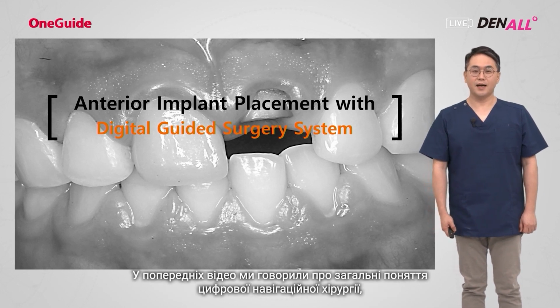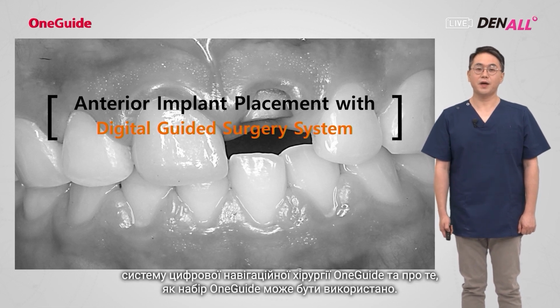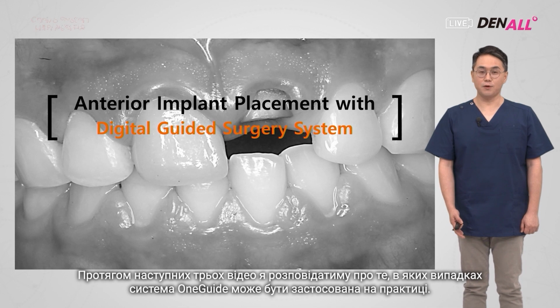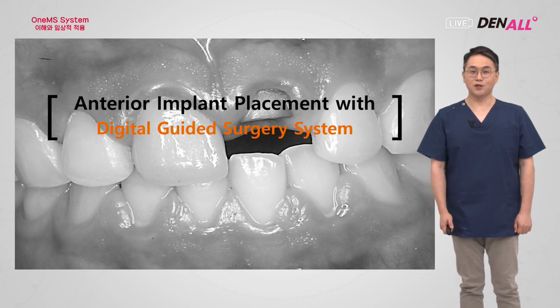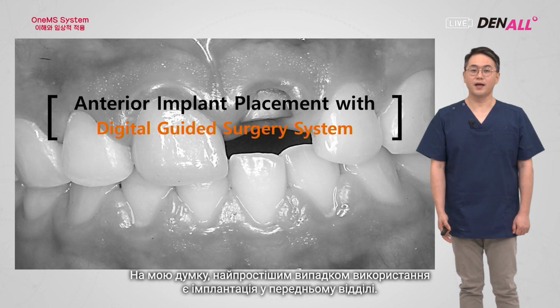We looked at the overview of the digital guided surgery system, and I also introduced the One Guide system. And lastly, we looked at how the One Guide kit can be used in the last sessions. For the next 3 sessions, I'm going to tell you in which cases this One Guide system can really be applied.